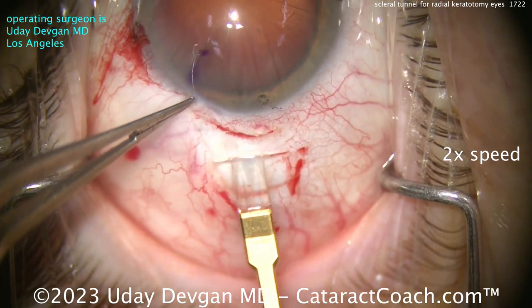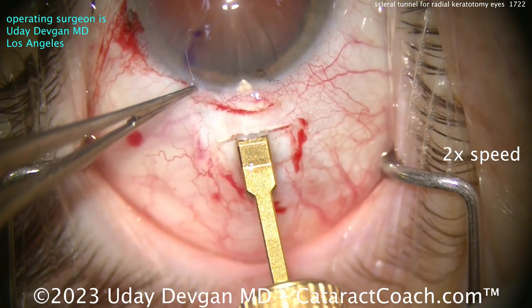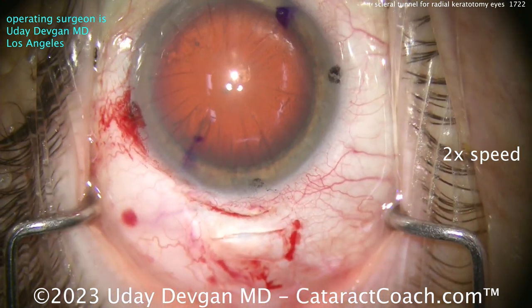Now I'll switch over to a diamond keratome. Wiggle it to go inside there so you don't create a new path — I want to use the existing path. Now we can enter the AC and widen that up to about 2.2 millimeters or so.